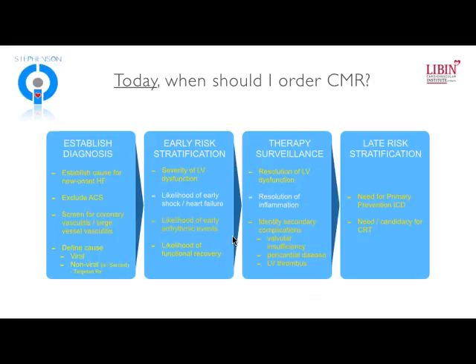Early risk stratification, I do think that we've got some early demonstration that we can predict patients that are more likely to have functional recovery. I think this is still an evolving field, though. I think we have lots to learn, but I do think that we have potential value in trying to discriminate those that within the first 6 months or so are going to have either recovery of function or go on to have complications.